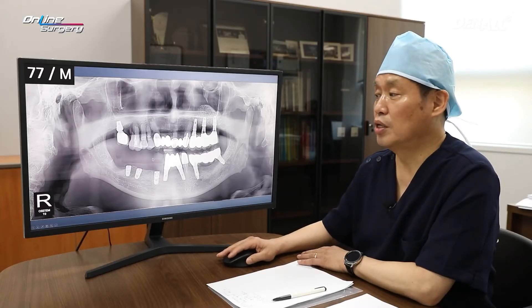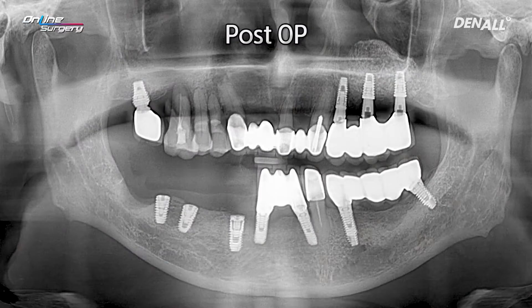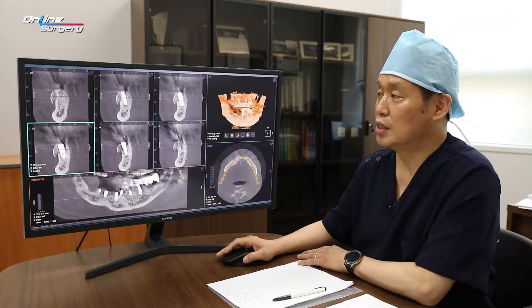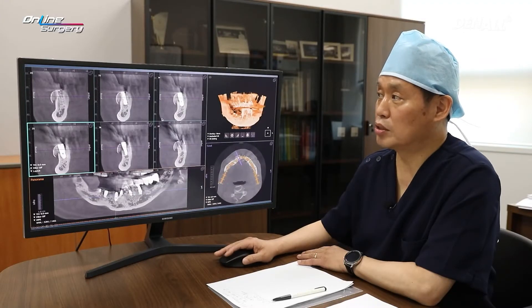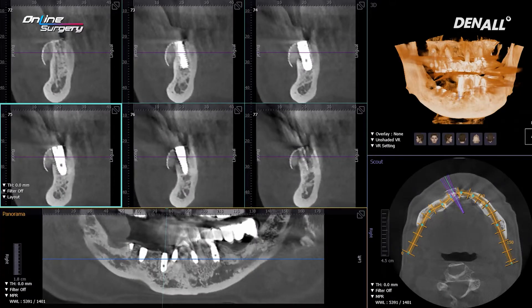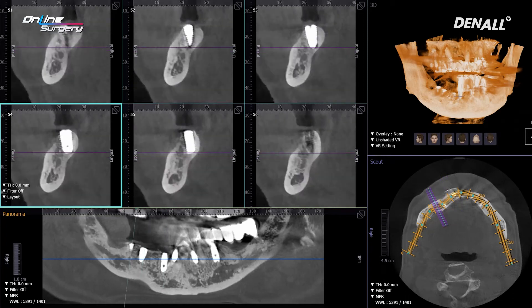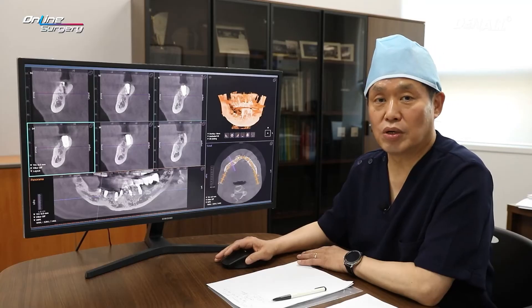This is the post-op x-ray panoramic image. As mentioned, on the canine, implant was placed and GBR was done, and two implants were placed in number five and six. Looking at the CT post-op, after implant placement on canine using OzBuilder, GBR was done, and number five and number six implants were placed. Let's take a look at the surgery.